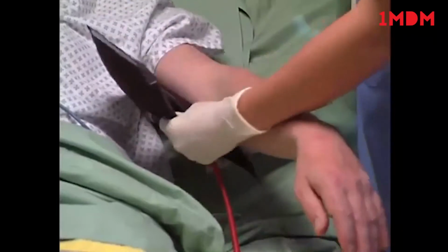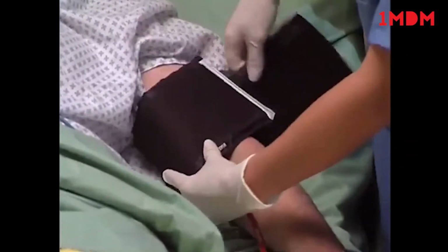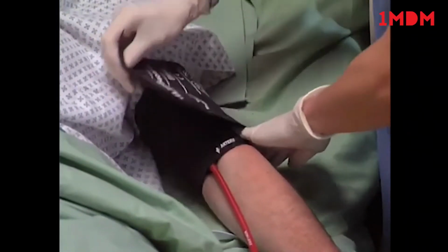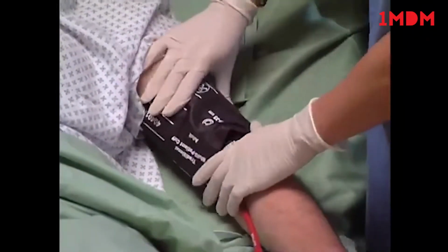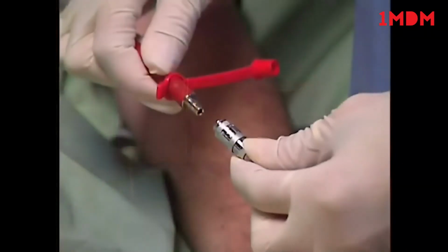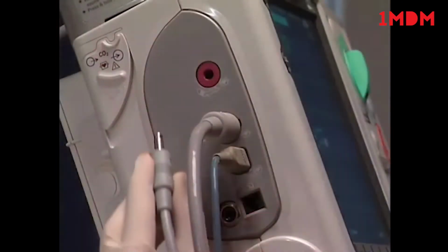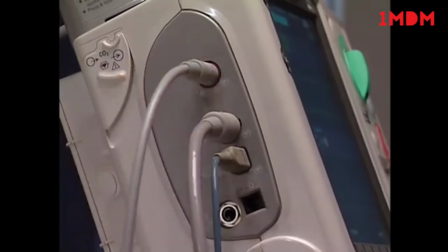The MRx can also monitor non-invasive blood pressure. The measurement can be done automatically or manually. The first step is to select the appropriate size cuff. A properly sized cuff should span approximately 2/3 of the distance between the elbow and the shoulder and wrap around the limb meeting in the indicated area. Attach the cuff to the tubing and the tubing to the NBP port on the measurement connector module.